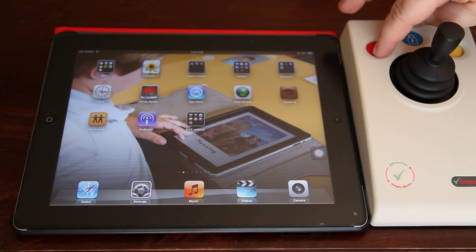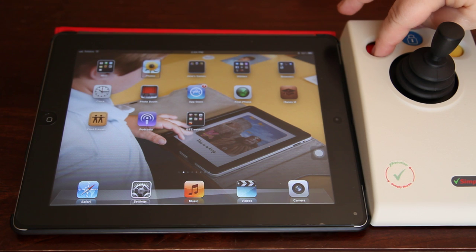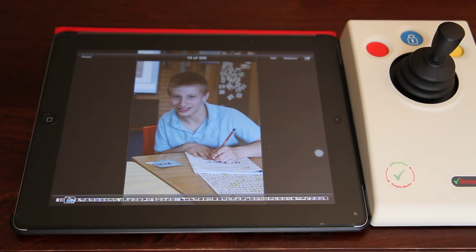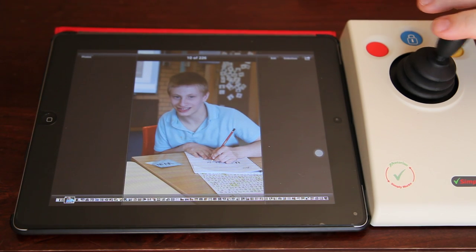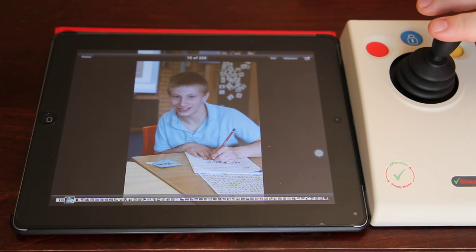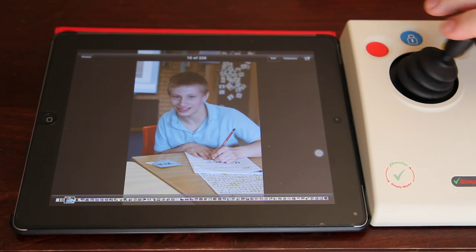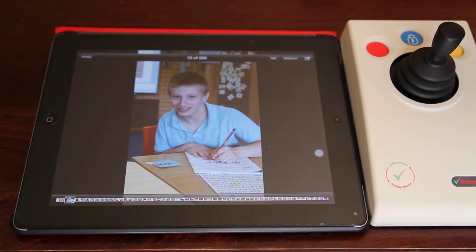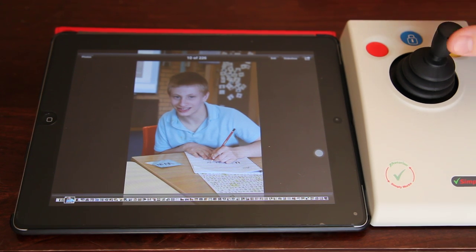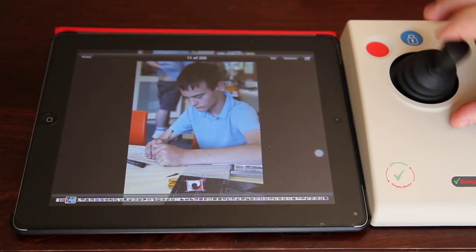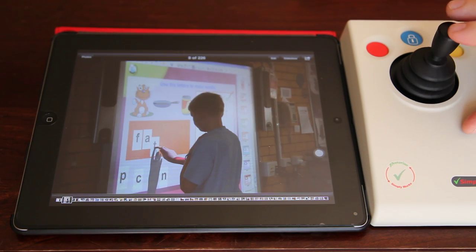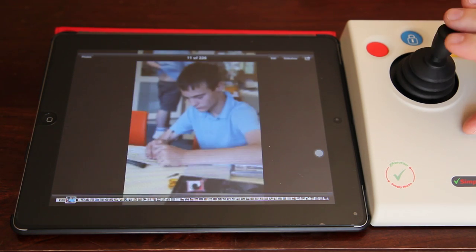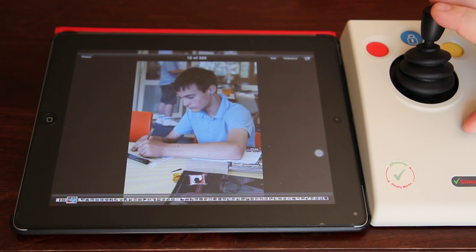The three buttons — the first one, the red one, selects. So if I want to open the Photos app, I select that now. I'm using the joystick to move the VoiceOver cursor around the screen. I'm only moving the joystick from left to right — if I move it up and down, because I'm in this app, something happens: it scrolls between my photos.